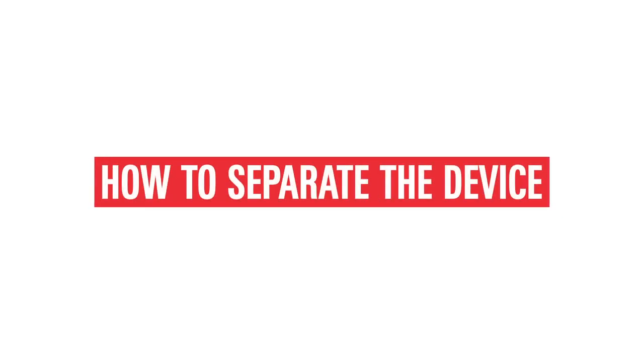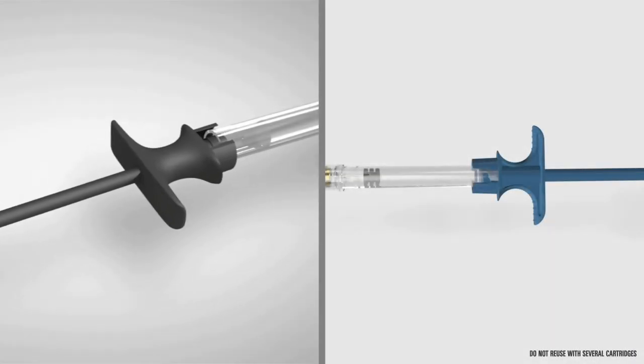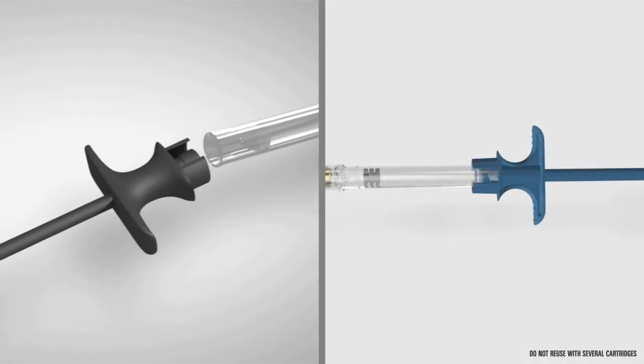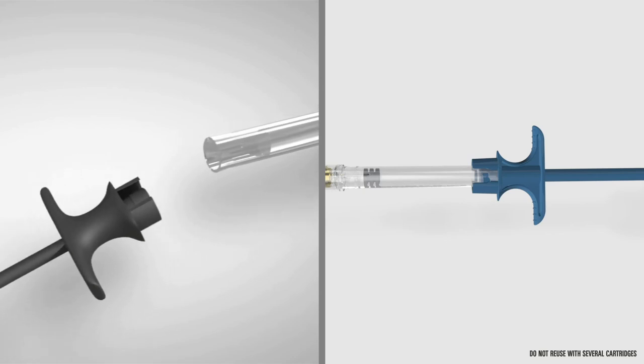How to separate the device. If you need to change the cartridge or dispose of the syringe, with ULTRA SAFETY PLUS, you could just separate the handle from the syringe body by pulling them apart.